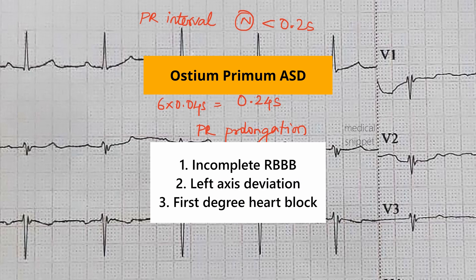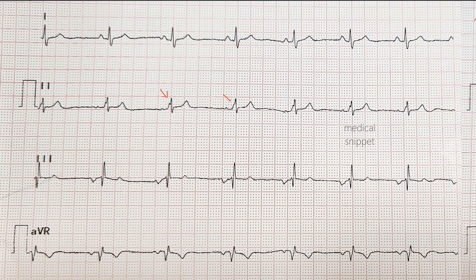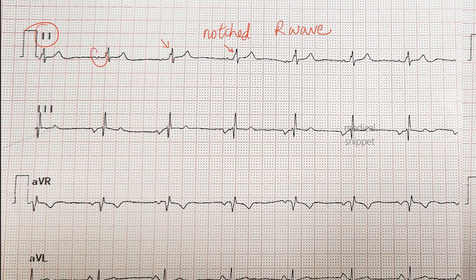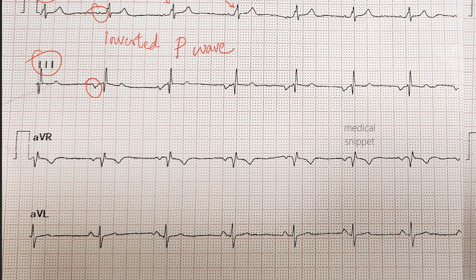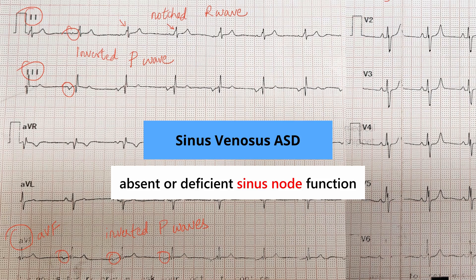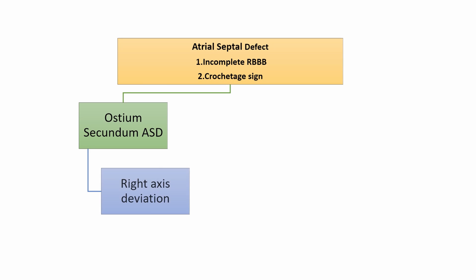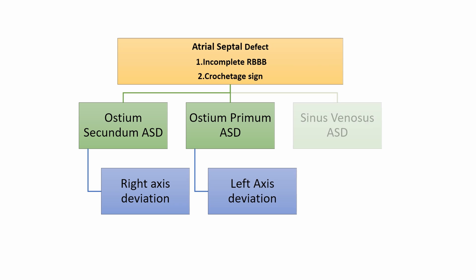Let's see another ECG. There is incomplete right bundle branch block — that is RSR pattern in V1. There is a notched R wave in lead 2, that is the Crochetage pattern is present. And if you carefully look, there are inverted P waves in the inferior leads — that is leads 2, 3 and AVF. The inverted P waves in the inferior leads are suggestive of absent or deficient sinus node function. These findings point towards the diagnosis of sinus venosus type of atrial septal defect. It should be noted that ECG findings can only point towards the diagnosis of ASD — it has to always be confirmed by echocardiography.